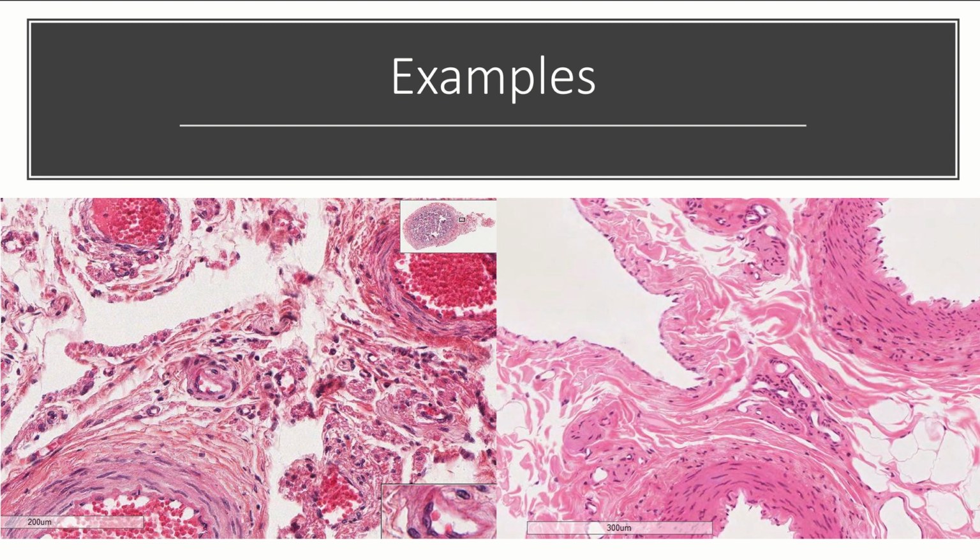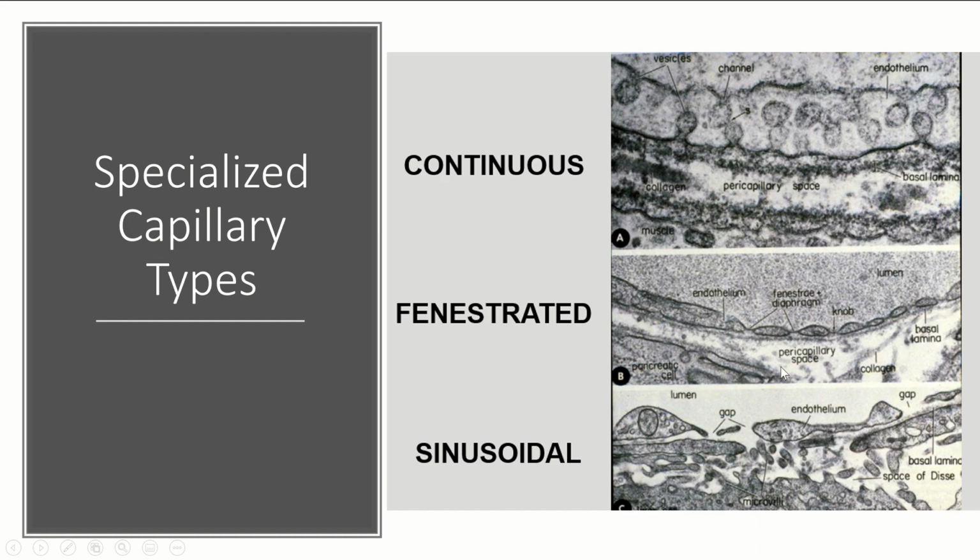Another way that you can tell the difference is because these arteries have a very thick lining of tunica media around them of smooth muscle, it keeps them relatively circular, right? And that's important because we want our arteries to always stay open and to stay perfectly circular. Veins, we don't really care if they collapse. They don't need that kind of supportive network. And so they're not always going to be perfectly circular. Most of the time, they're going to be very squished and weirdly shaped. So here you can see this, I know, is a little vein or venule because it's squished and it's not very circular. This one is kept open and very circular, so I'd say maybe this is an arteriole. Okay, so hopefully that helps you all keep the difference.